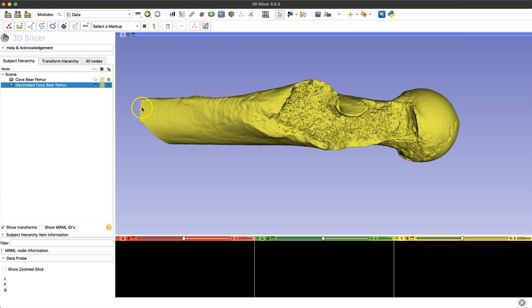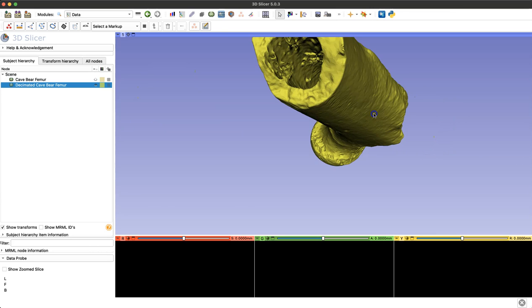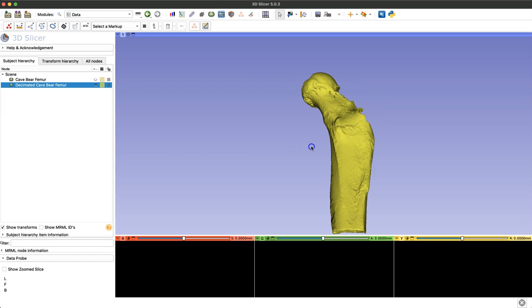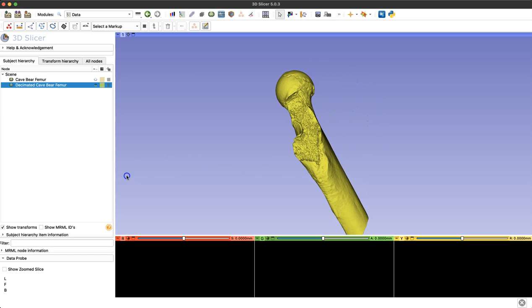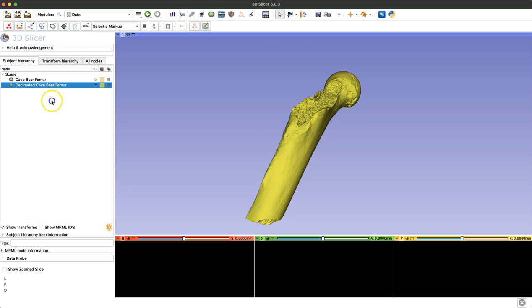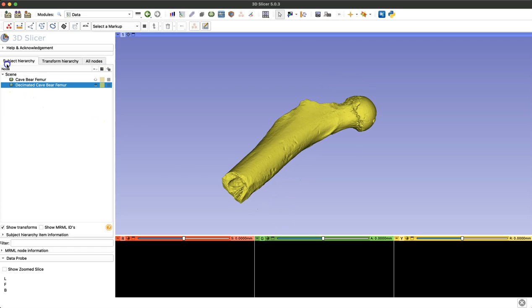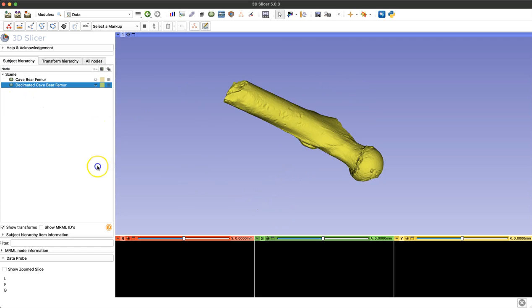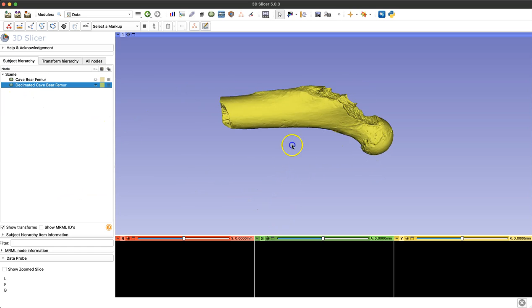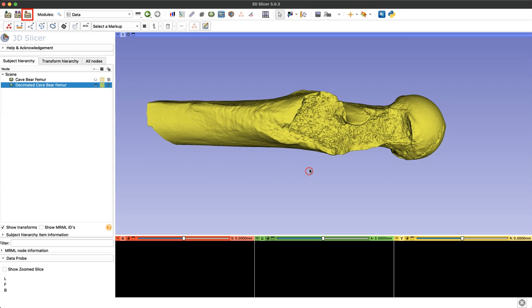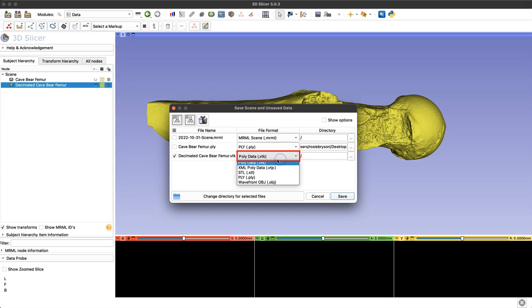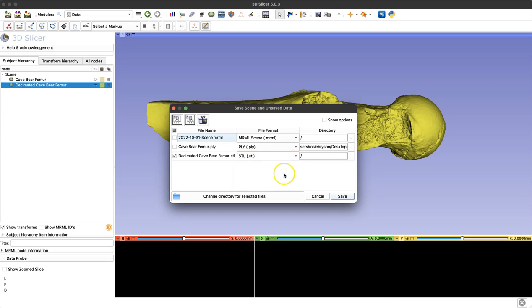Now I'm happy with the detail that we're still capturing with this newly decimated model, so the final step will just be to save this new model and check out our new file size. For this I'm just going to click the save icon in the left hand corner and I'm only going to select my new decimated model. I'll switch that file format to an STL and I'm just going to direct that file to go to my desktop by clicking the ellipses, and click save.